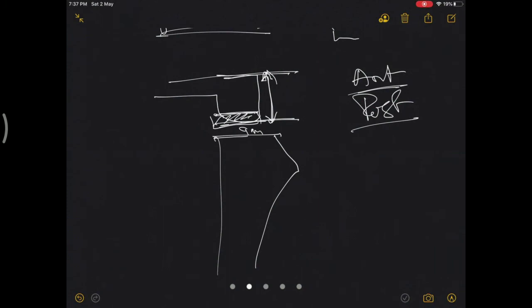So you will first measure the anteroposterior diameters, and based on that, you have a size of the femoral component and a matching cutting block for that size, which upon using eventually cuts this 9 mm. Okay, so what we have to do is we measure the anteroposterior diameters, we get to know the size, and then we use that sized 4-in-1 block to cut it.